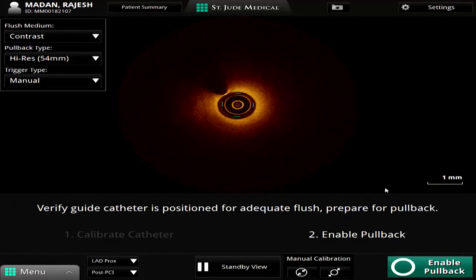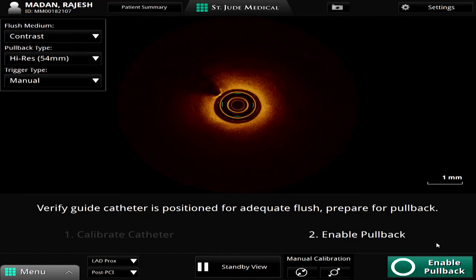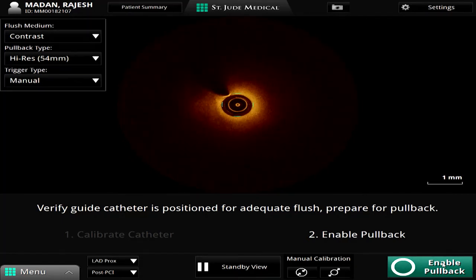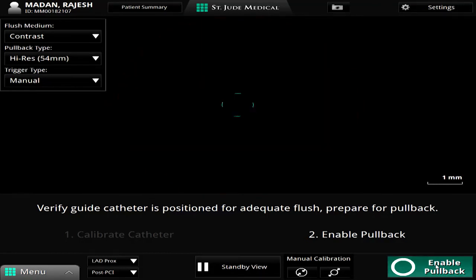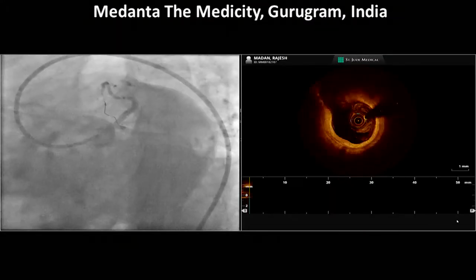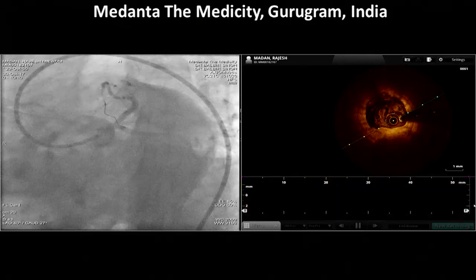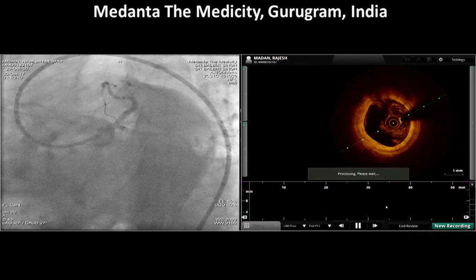With this, I will protect the proximal end of the stent, because the current generation of stent is normally very thin, like between 60 to 81 micron. So if we are not very careful, we can induce a concertina effect or accordion effect in the proximal end, or damage the proximal end of the stent. So before the balloon is fully deflated, I introduce the guiding catheter in, because we know that the left main diameter is already big enough to accommodate the guiding catheter.